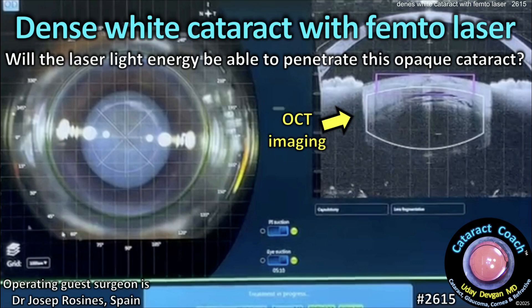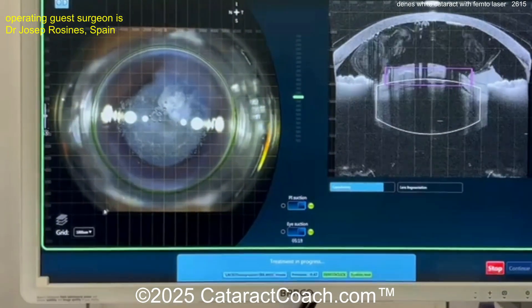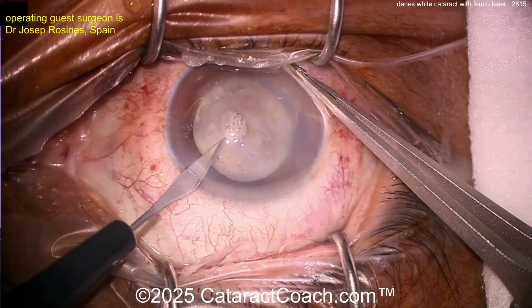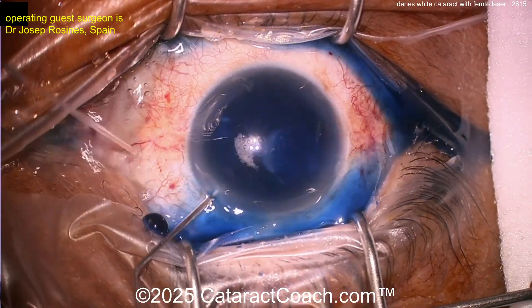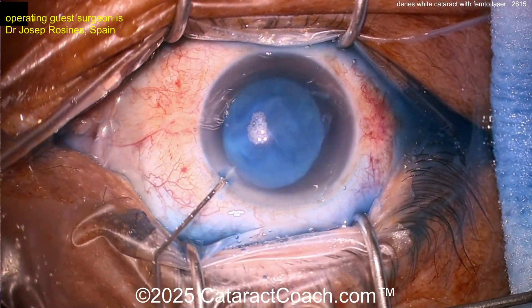cataractcoach.com — a dense white cataract with a femtosecond laser. Will the laser light energy be able to penetrate this opaque cataract? Here we go. On the OCT image and the microscope image, you can see it was able to make a capsulotomy. Sometimes when the intumescent lens fluid comes out of the capsule bag, that can block laser light transmission.